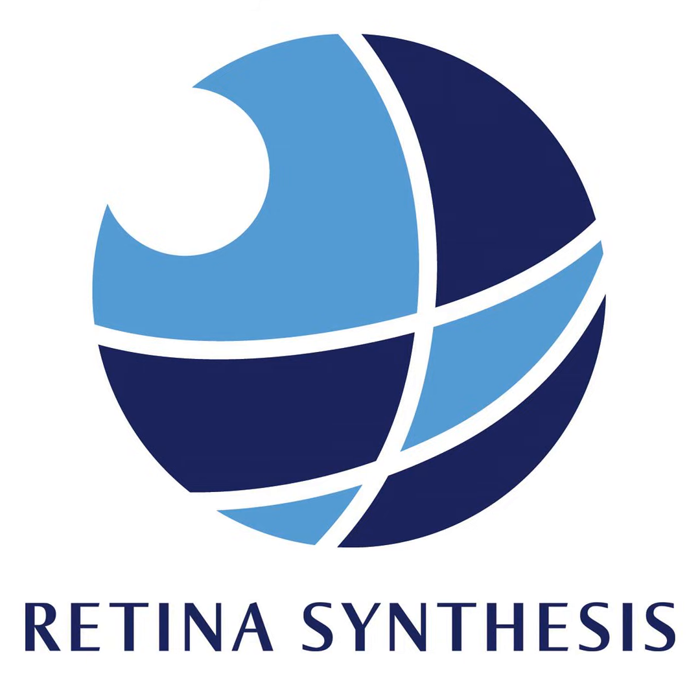Common applications, I think, is really any vascular disease of the retina. The ones we see most are diabetic retinopathy and age-related macular degeneration. You can't go through a retina clinic without having half a dozen or more of each one of those at least. So that's really where it matters most. For diabetic retinopathy, the wider field, which I think we'll talk more about today, is perhaps more relevant because you want to look for neovascularization in some cases. But even the macular scans are very important because you want to see how much macular ischemia there is to judge what the visual potential is.